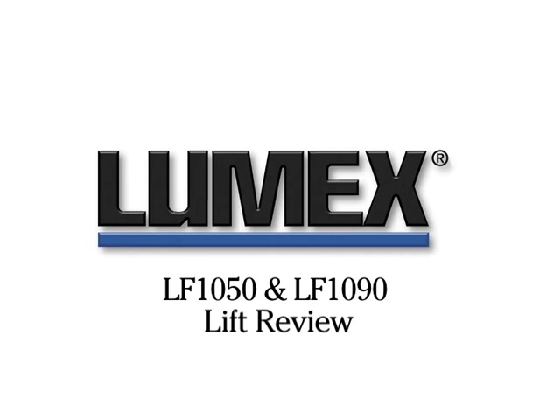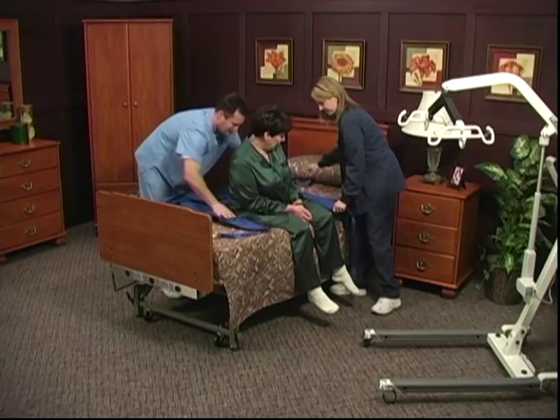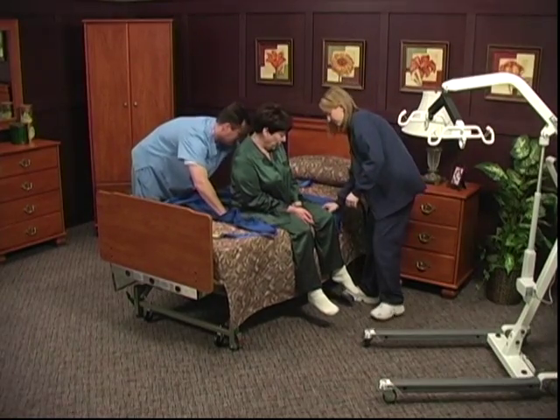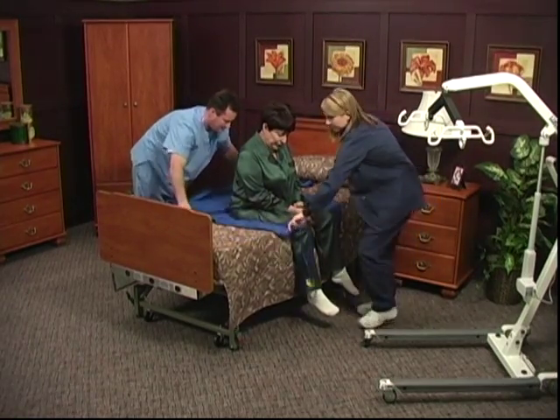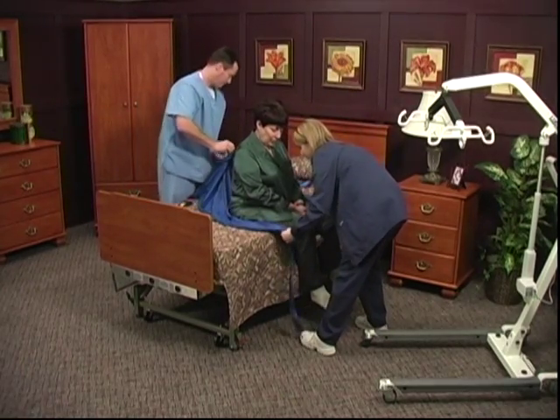The Lumex LF-1050 and LF-1090 Lift Review. Lumex lifts enable the caregiver to safely move or transfer a resident with confidence. This video will review the LF-1050 and LF-1090 electric lifts.